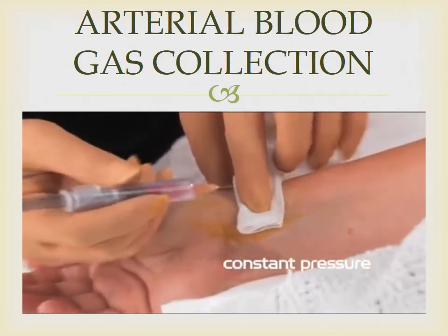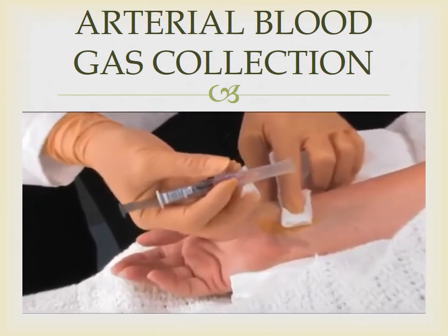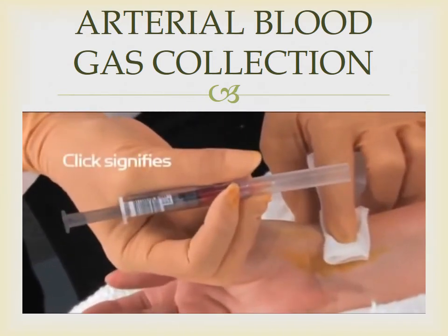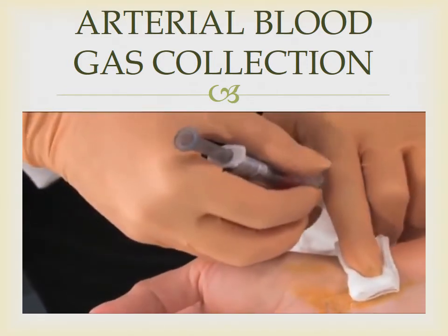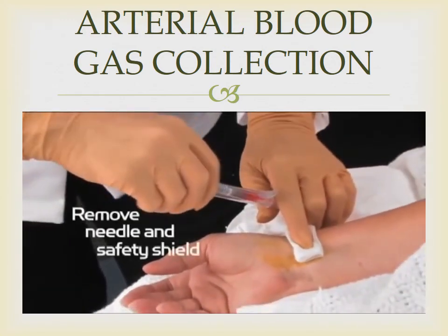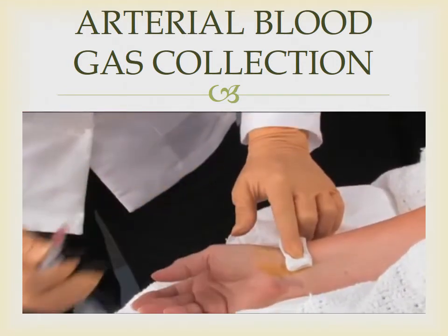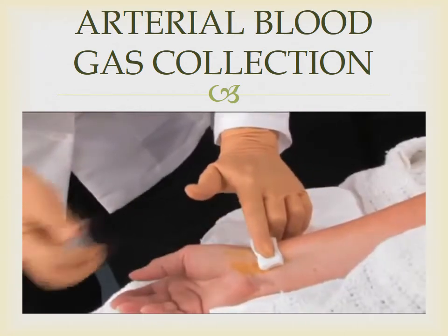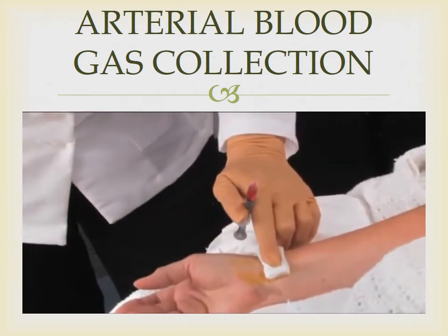Holding the sampler in one hand, place your thumb toward the back of the safety device thumb plate, and without pressing down on the plate, gently slide the protective shield over the exposed needle until a click is heard. The click signifies that the protective shield is locked in place and the needle is no longer exposed. Remove the needle and needle safety shield device by holding onto the syringe barrel wings while twisting the needle shield device. Discard in a sharps container.